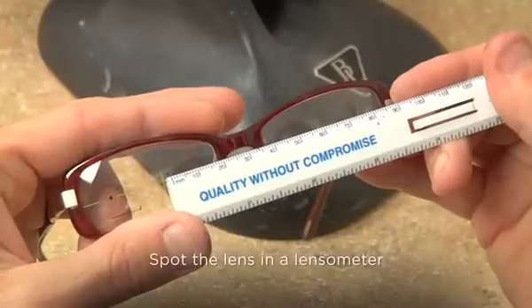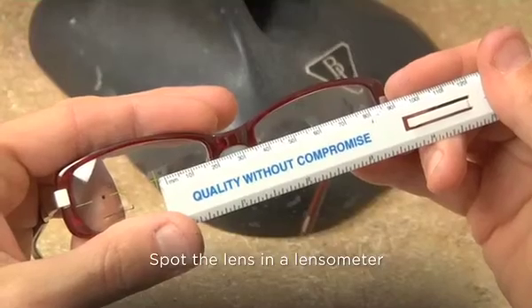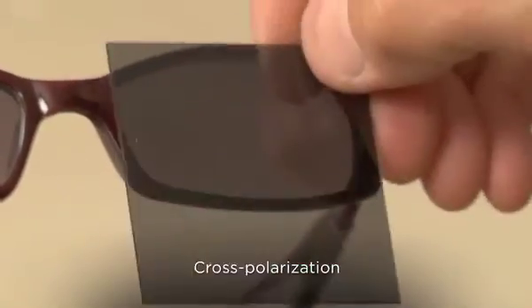If this occurs, spot the lens in a lensometer. In the rare event that you cannot check the alignment with a lensometer, another option is to fully activate the lenses and cross-polarize them with a piece of polarized film.